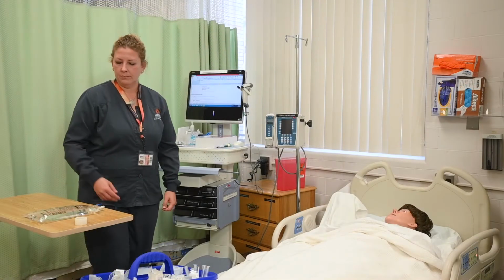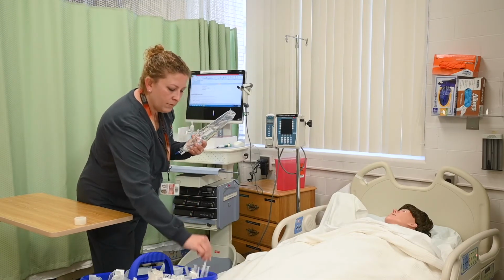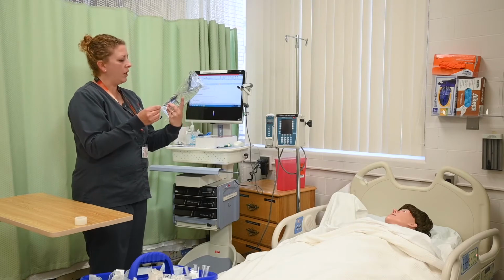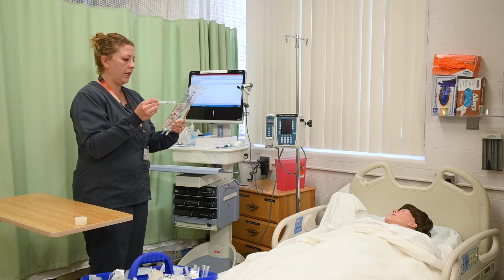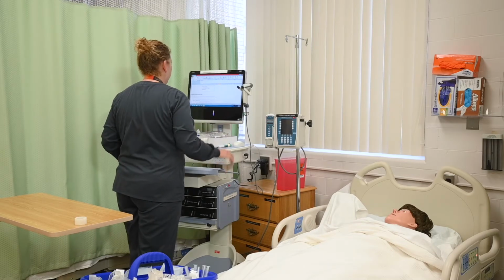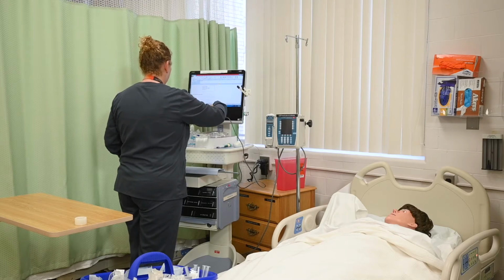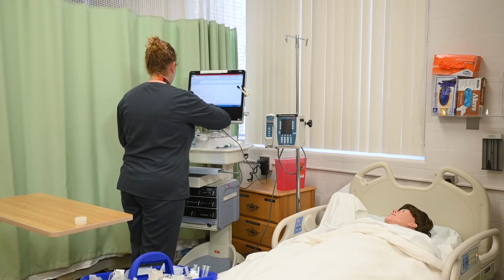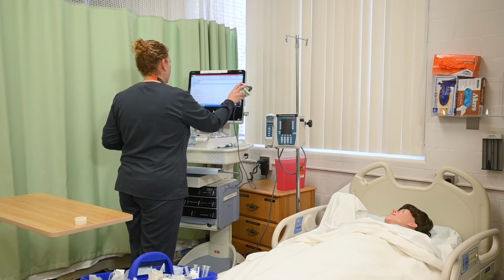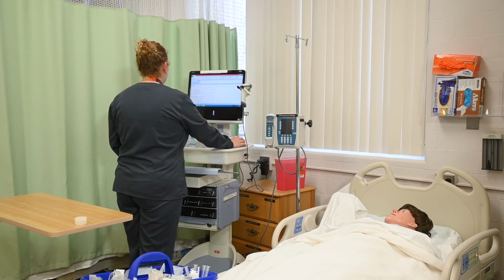Sarah will select and scan the correct IV solution in normal saline flush. Checking for color and clarity. Expiration date. She will now perform the first check of the 5 rights of medication administration of both the IV solution and the normal saline flush, comparing it to the MAR, checking for patient, medication, dose, route, and time.